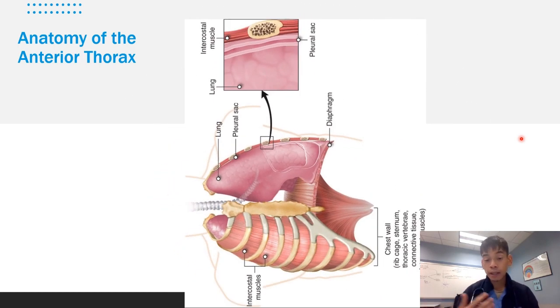And we'll have the patient laying supine. Most likely they'll be laying down. So I try to twist this in a way so it would be imitating a patient. And as they're laying down and you look for the 3rd or 4th intercostal ribs, you'll go ahead and place a probe indicator here. And then that will show us exactly what we're trying to find.